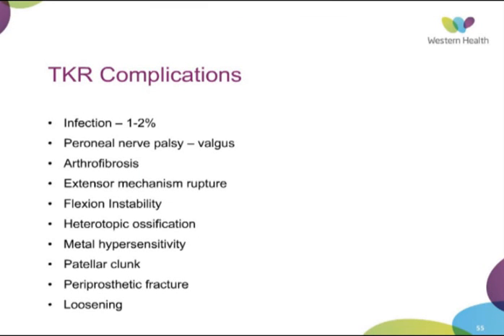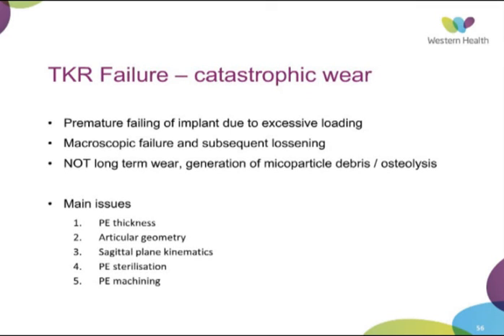Just quickly on complications, there are a number of complications of knee replacement, and our patients need to be aware of those when they're consented. And one thing that I wanted to briefly mention after we've talked about the design of the prostheses is failure, and in particular it's been shown that excessive loading in the prosthesis, which is what we're trying to avoid by both our prosthetic design and our techniques intraoperatively, can cause early catastrophic failure, mainly because of the polyethylene either microscopically or macroscopically failing.